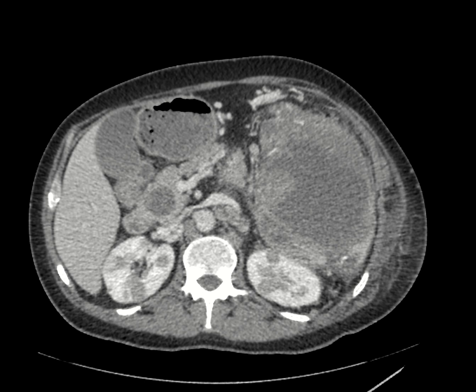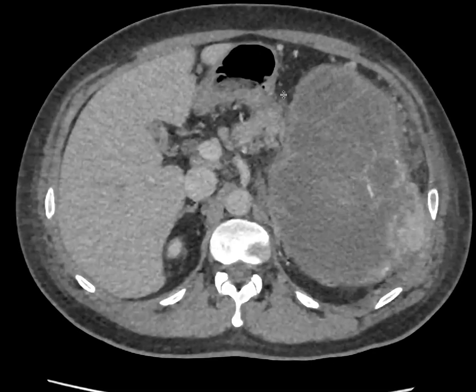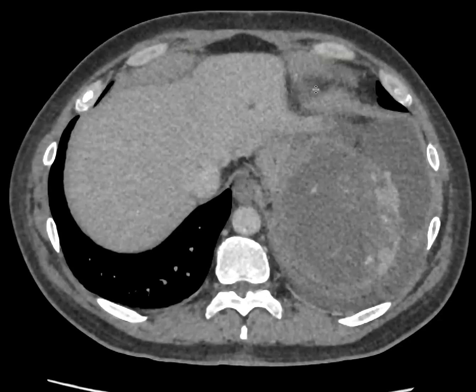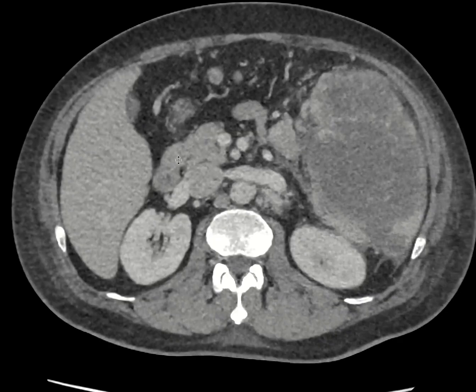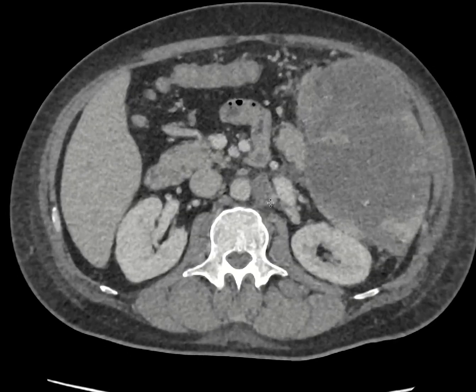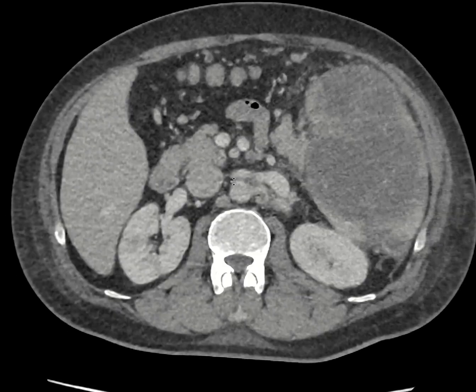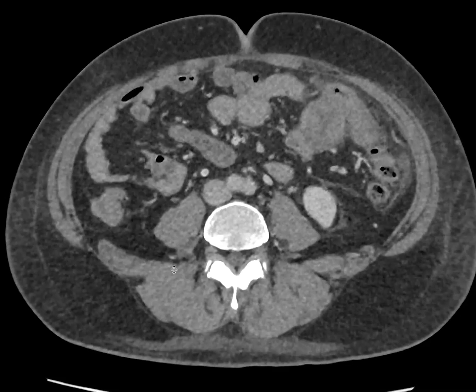This patient was treated for lymphoma and ended up getting a follow-up, and here's the CT scan, where we can see the splenic mass looks decreased in size from the prior examination, and there's interval near complete resolution of the pancreatic masses. Here's our retroperitoneal left periaortic mass, much smaller than before, and we can see the renal lesions have by and large resolved.